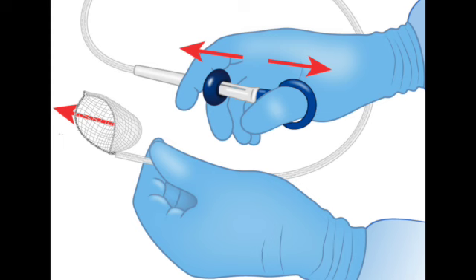Safety first, always. Now, let's shift from getting it out to keeping it good. Preservation. Once this big, maybe fragile polyp is out, how do you prepare it for the pathologist? Standard procedure, I assume, is just drop it in a formalin jar. Yeah, for many cases, that's standard. Retrieve it, put it in the formalin. But the source pointed out something more specific, right, for certain situations, like when the pathologist needs to be absolutely sure about the edges, the margins.